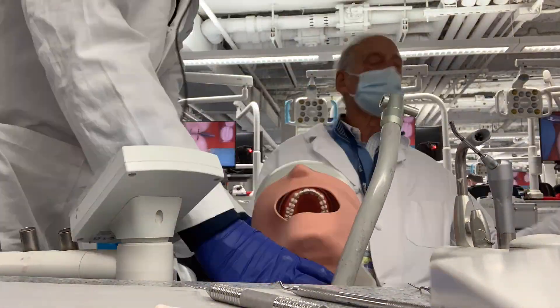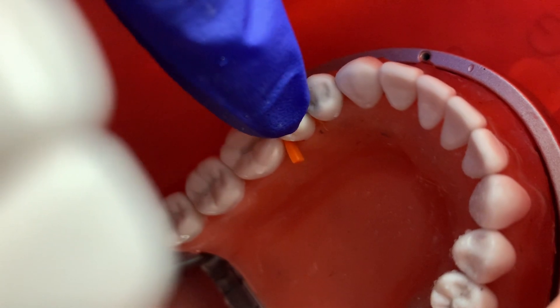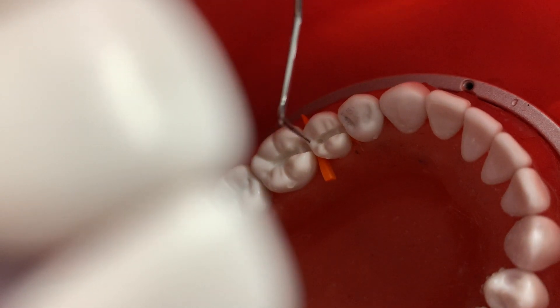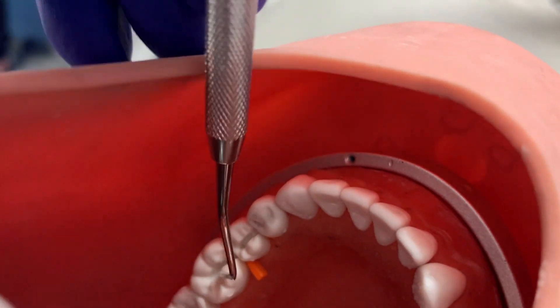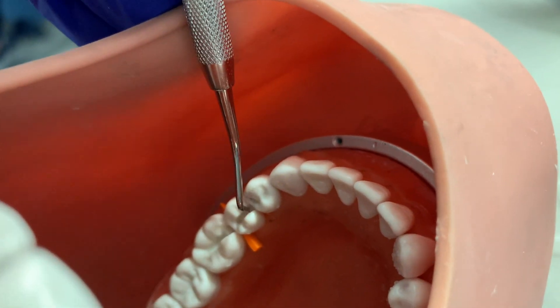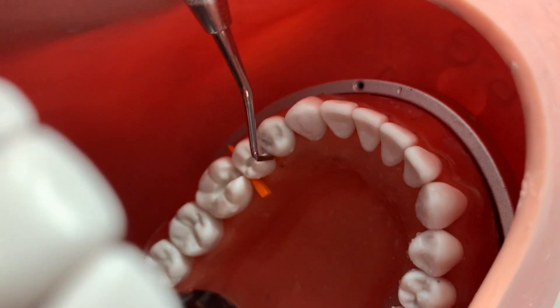Shoutout to the absolute legend himself, Dr. Conrad — you're going to see him very shortly. He helped me out and gave me some awesome tips. What I'm trying to do is create a line across here, and we want that line to be 1.5 millimeters deep, which we can measure with our perio probe. From there we're creating a step, and we also want our small hatchet to pass through without resistance — which we're getting there. It's not really getting stuck, maybe at this end I need to polish a little more.